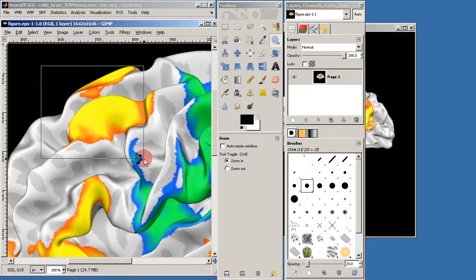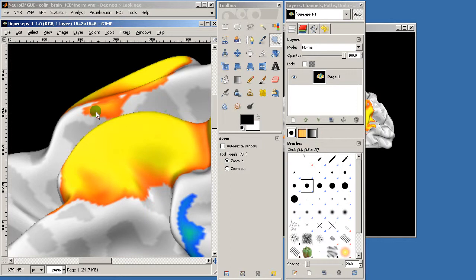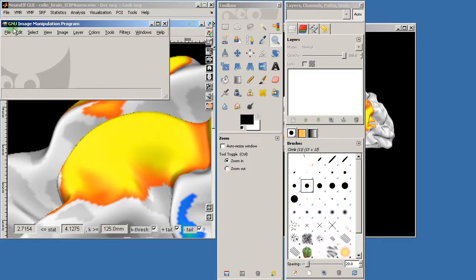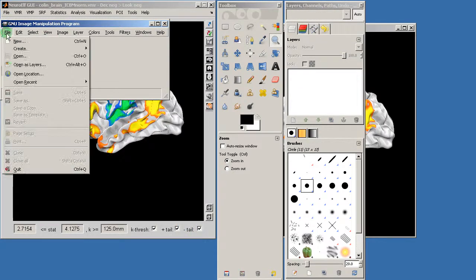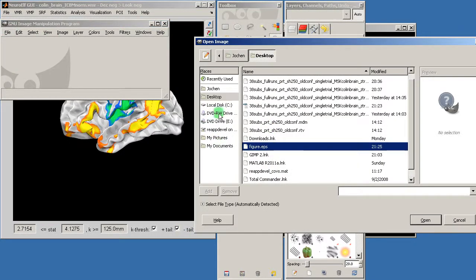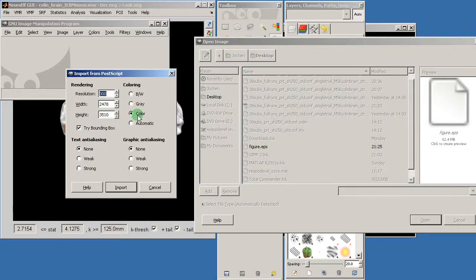And only if you zoom in to a really high zoom level then it becomes pixely. And even that can be avoided by importing the file to an even higher resolution, let's say 600 dpi.